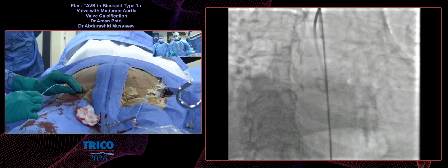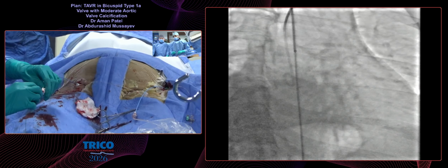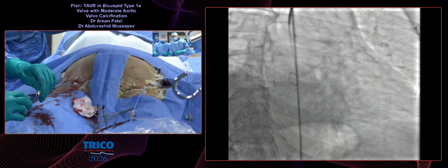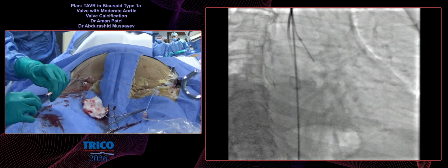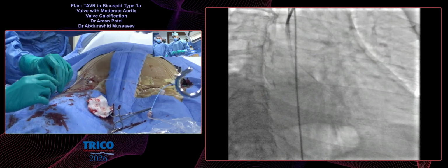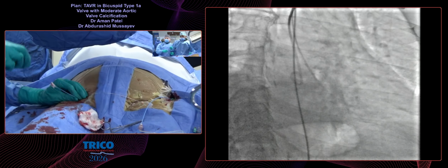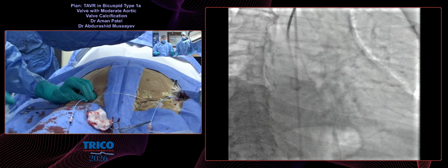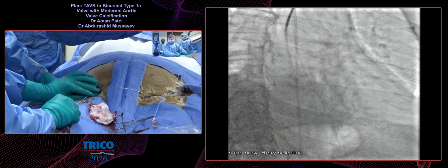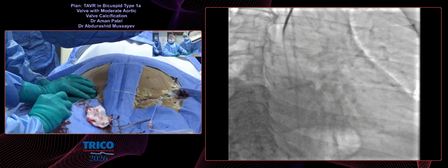Aman, is the valve crossing done on this 7 French sheath, or would you probably want to put the larger sheath and then go through that? Now we try to cross first to the LV. Now it is crossed very fine with the Lima catheter, as you see. So how do you choose between the Lima catheter, RCA, AL1?